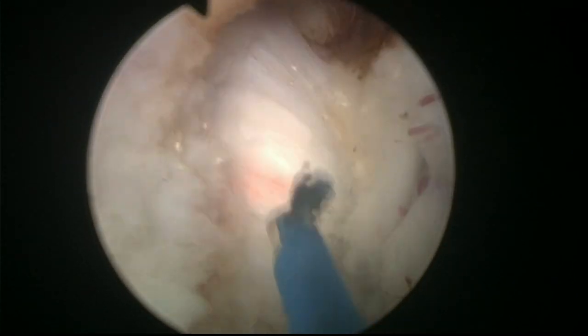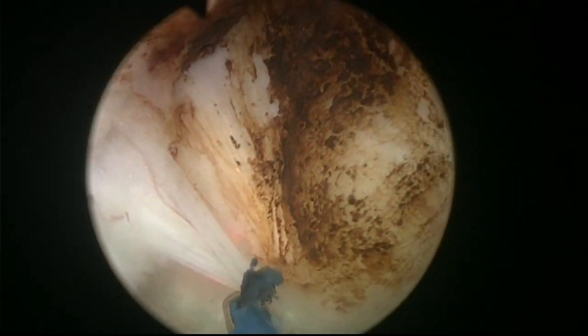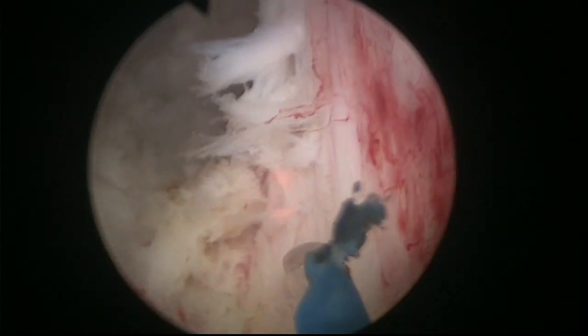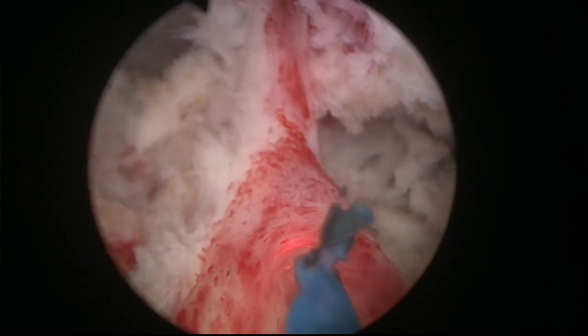These are tips and tricks I picked up on the way. So we have achieved an incision that goes from the bladder neck towards the plane. Here is the verum montanum. By localizing the plane at the beginning of the operation, now we know where the plane is coming from.